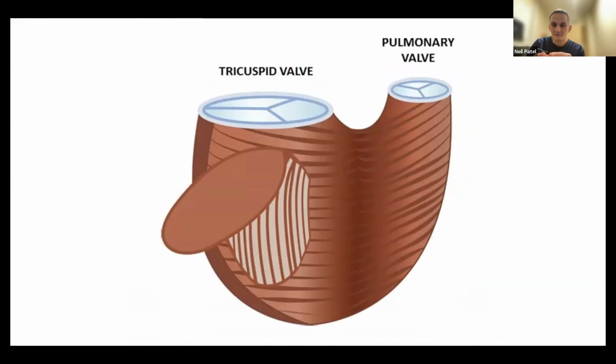In this representation of the right ventricle, there's very important contribution from those endocardial longitudinal fibers in the right ventricle, contributing to the shortening as a dominant component of right ventricular contraction. But there's also the circumferential fibers in the right ventricle. It's not a donut, remember, that ventricle. It's more of a kind of wedge that is beside the left ventricle.